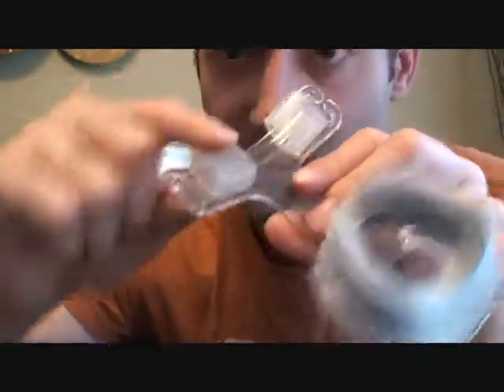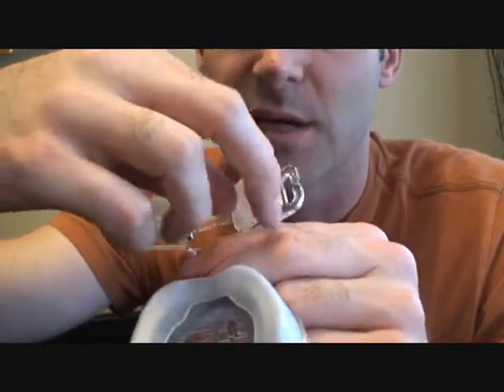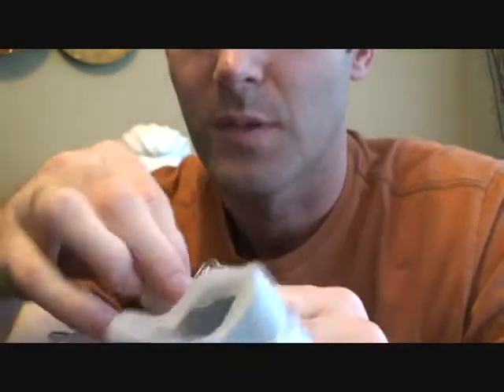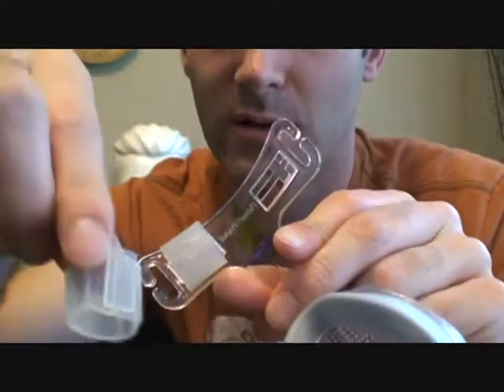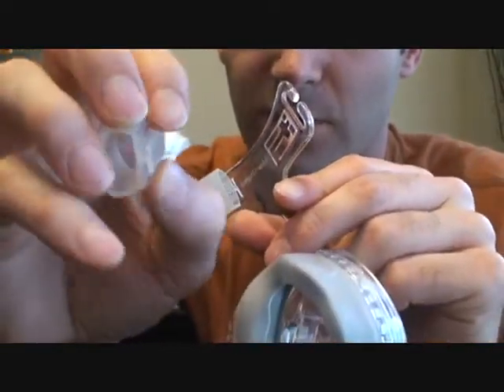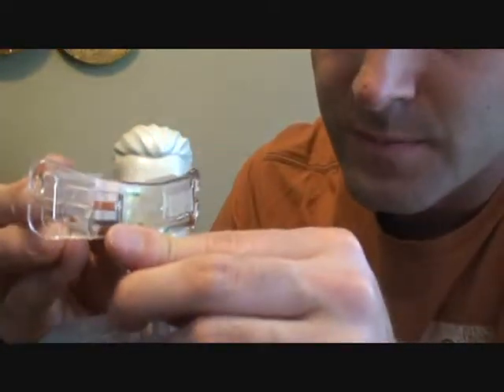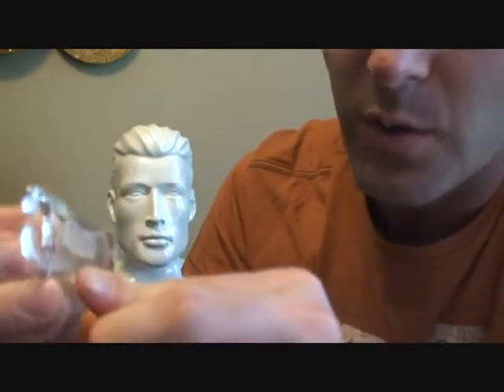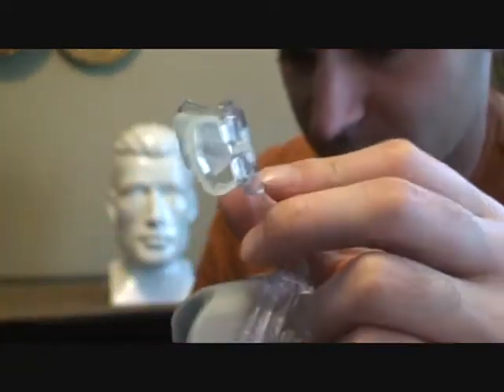So if you ever want to replace these cushions, the forehead pieces, which will leave giant crater marks here if you over tighten it, you want to pull them, the close side here on the outside. You want to slide it down just a tad, and that'll release here. Release at the bottom, and once that's free, you can slide that out. So you can see it's kind of like a butterfly wing. So to put it back in, slide through that, and you slide it on, and push it all the way through, and then you can see how it fits in. You just do that for both sides.